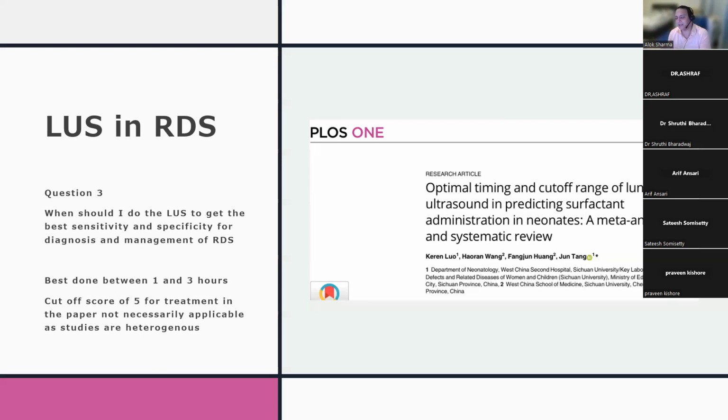And that's why I would say that what you have to do is give this baby a chance with good recruitment from whatever non-invasive strategy you want to use, so that you can do a lung ultrasound that gives you an educated assessment that this is really surfactant deficiency as opposed to a lot of other conditions.